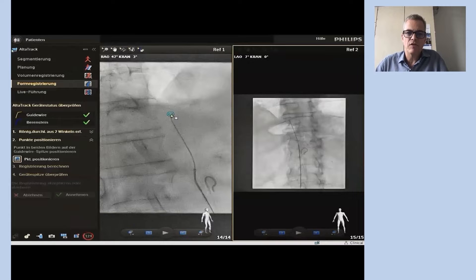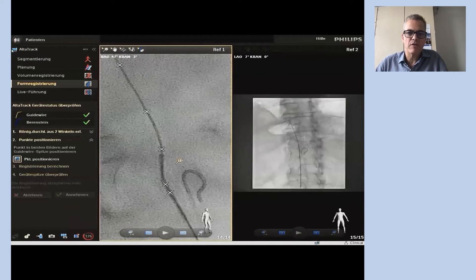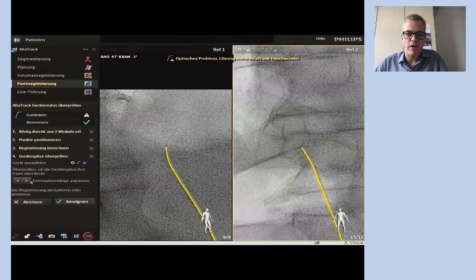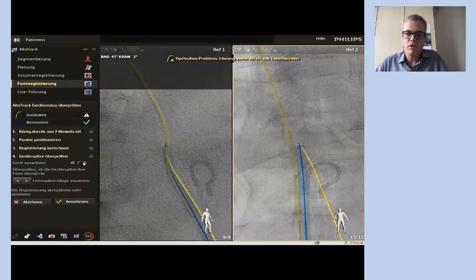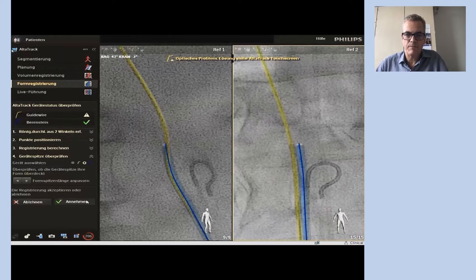The system recognizes the FORCE materials — you can see the wire in yellow and the catheter in blue — and the length of both devices are adjusted here.